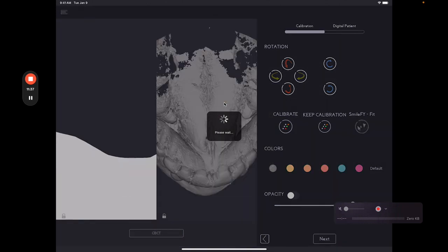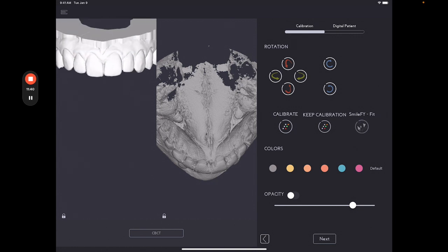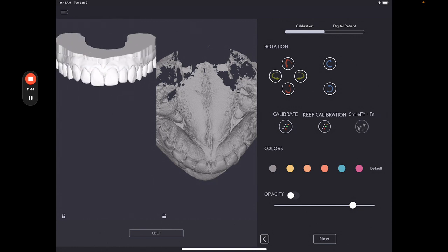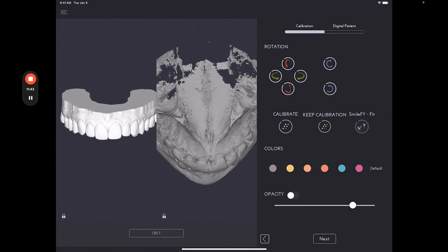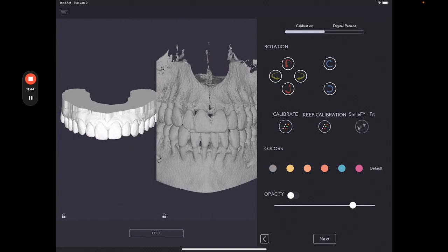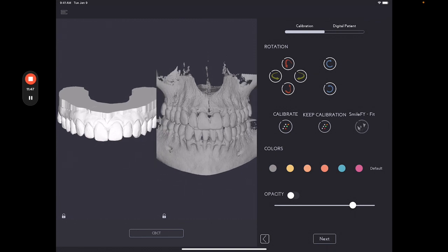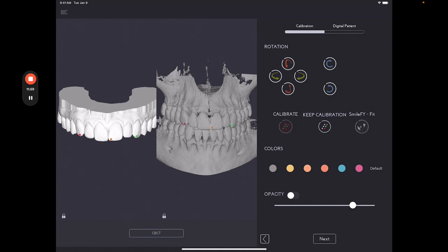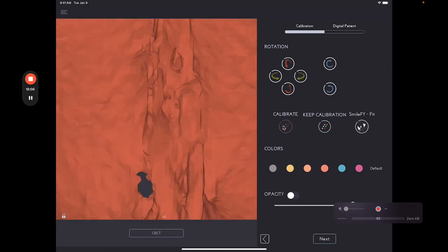We will set three points now on the canine. Another one on the central and another one on the other canine. And then over here, same thing. Canine, central, canine. And then let's select calibrate.